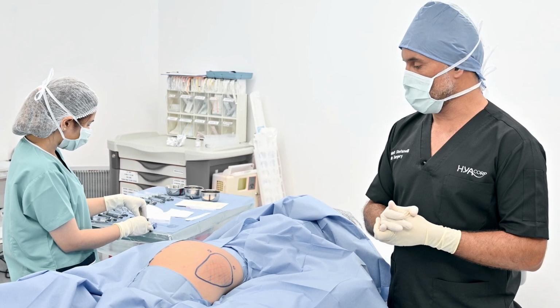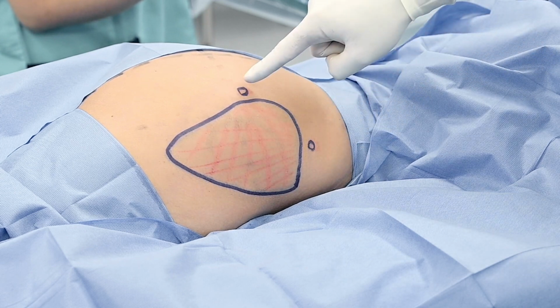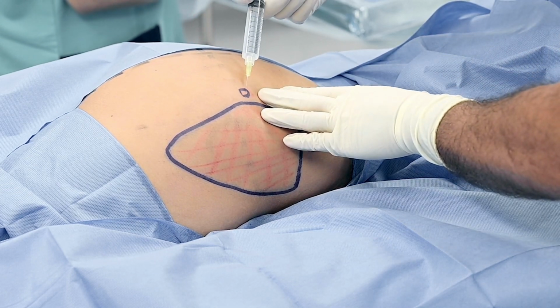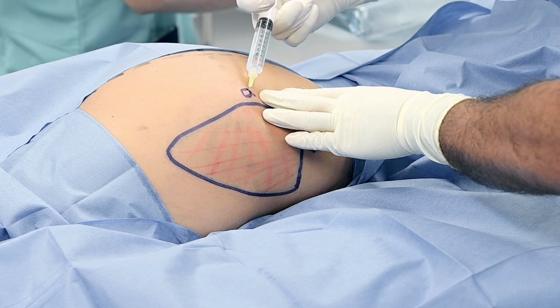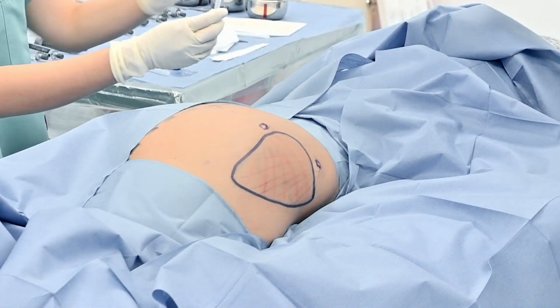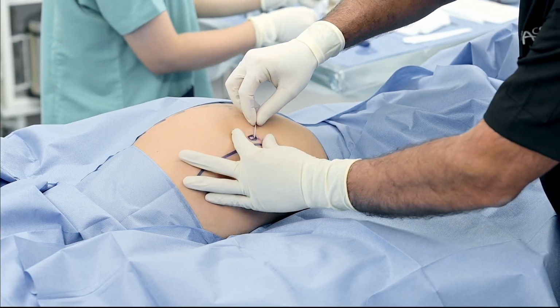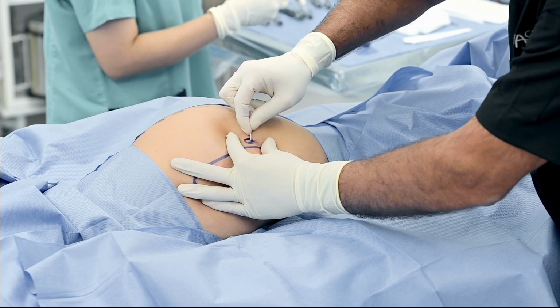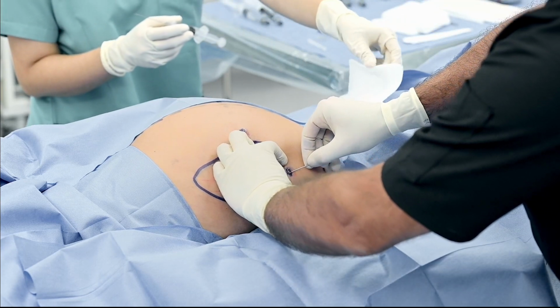Let's go. So we are ready now for the procedure of the second patient. We have here the injection zone and the two entry holes for the cannula. I'm going to start with the local anesthesia of the entry point with xylocaine adrenaline and a very small needle, 30 gauge. Now we take the 18 gauge needle and we open the hole by this lateral movement. And we do the same on this one.